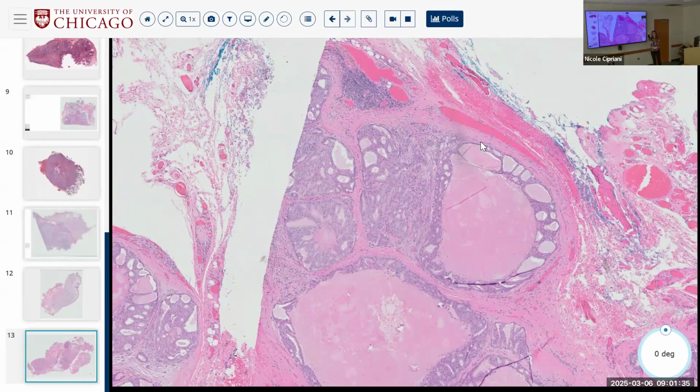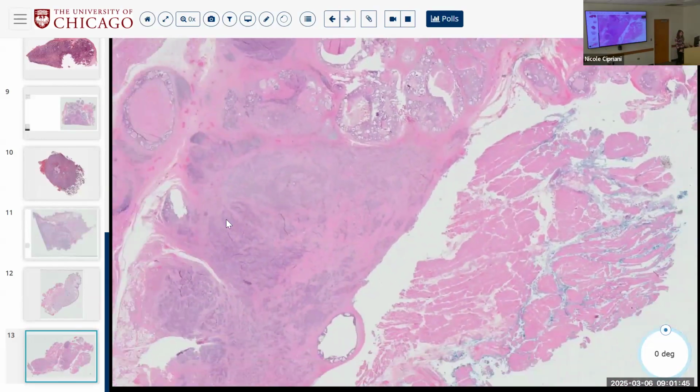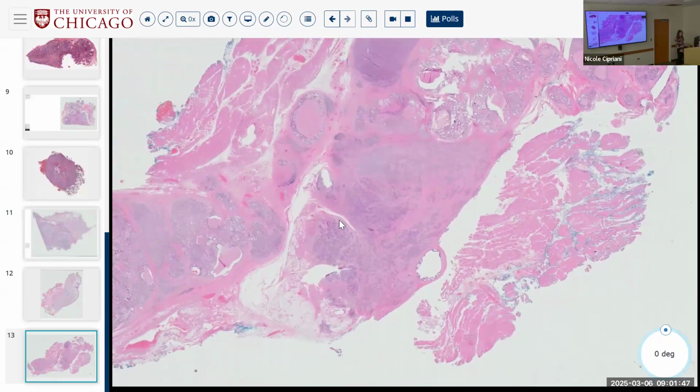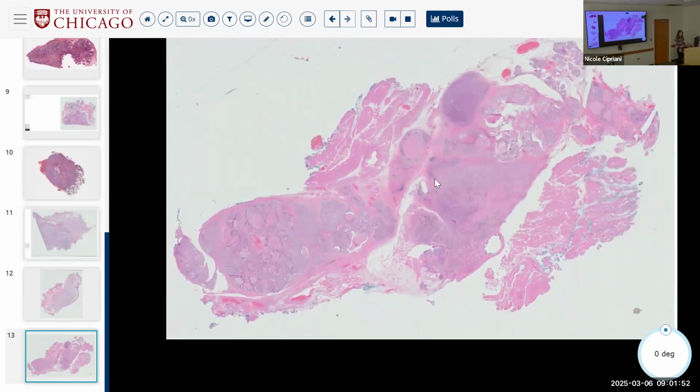So it can travel up the ducts. So if you see a P40 layer, that's okay, that can happen in these cases, but you should expect the majority of this to be P40 negative, because it's all infiltrated, okay? So salivary duct. I don't see a background pleomorphic adenoma here, although we know that this is one of the ones that commonly transforms.